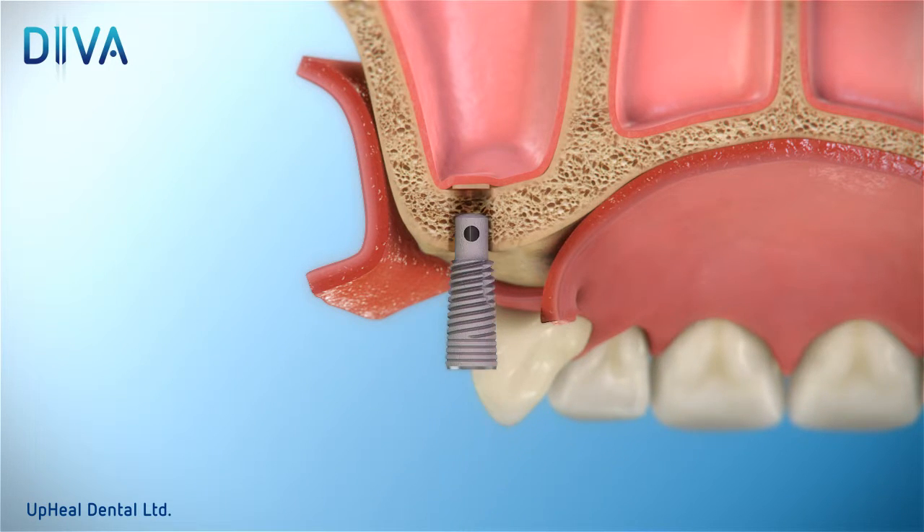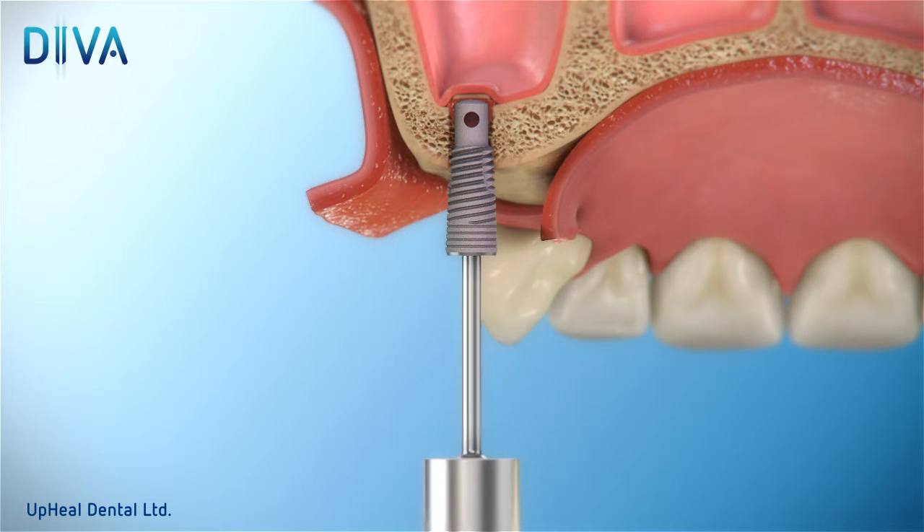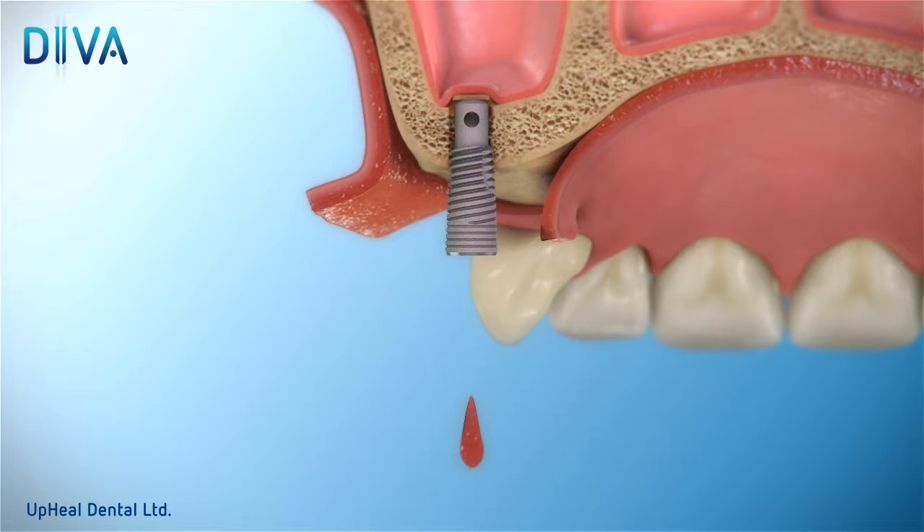Insert and carefully rotate the Diva device until initial primary stability is achieved. With the attached special driver, unscrew and remove the first valve screw located within the device. The bleeding you observe from the Diva channel indicates the sinus floor fracture.